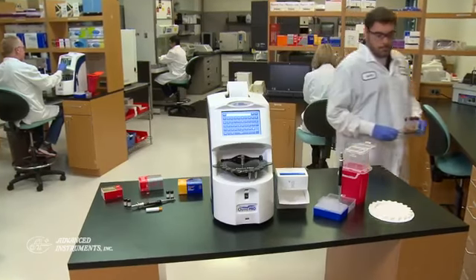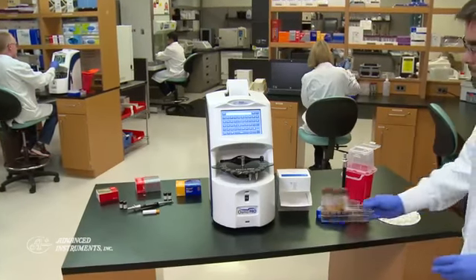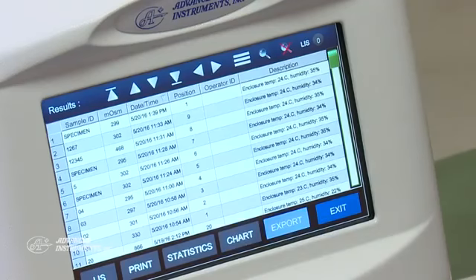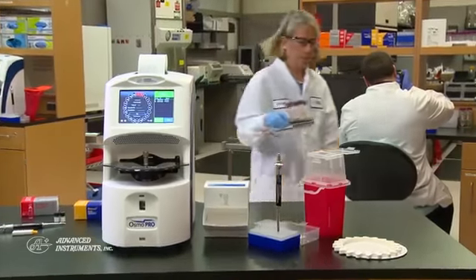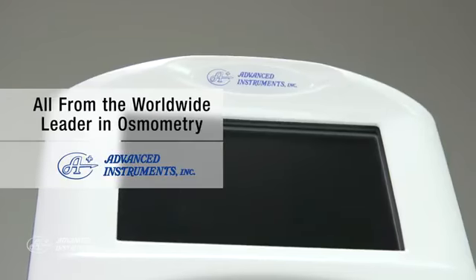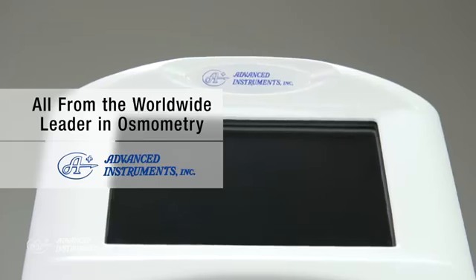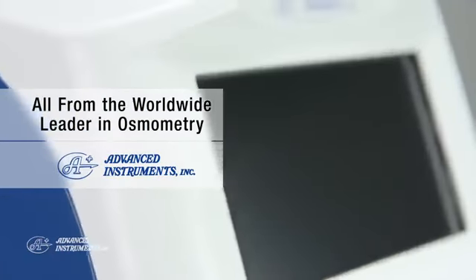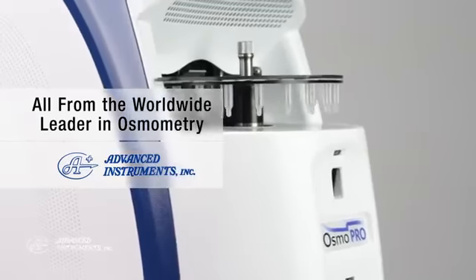OsmoPro improves your laboratory's efficiency. It ensures that your laboratory delivers rapid, accurate, and precise test results every time, for every sample — exactly what you'd expect from Advanced Instruments, the world's leader in osmometry. Discover how OsmoPro can make a difference in your laboratory and for your patients.